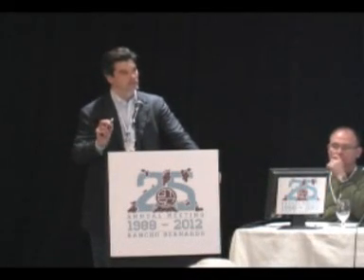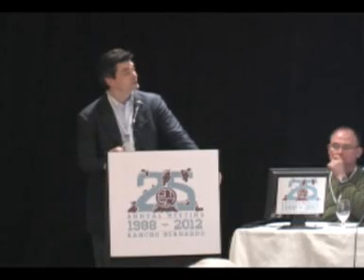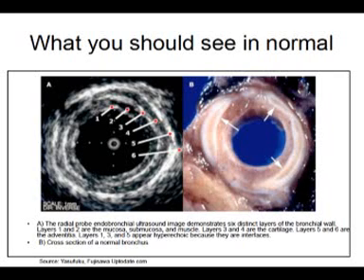Next. The miniature probe is used mainly for evaluating larger airways, and it has been shown to be more sensitive than CT scan in terms of predicting tracheal and bronchial invasion by lung cancers. There are 6 separate layers described. Really, for all intents and purposes, there's only 3. There's the mucosa, which is 1. This first hypoechoic area, which is the submucosa and bronchial musculature. And then this second hypoechoic area here, 4, which is the cartilage itself.